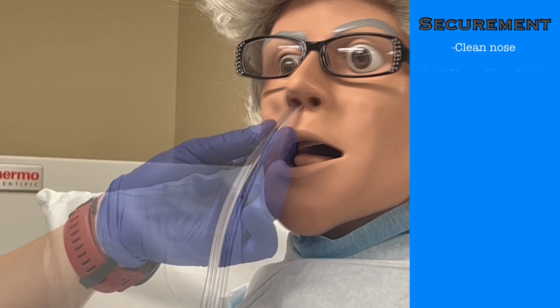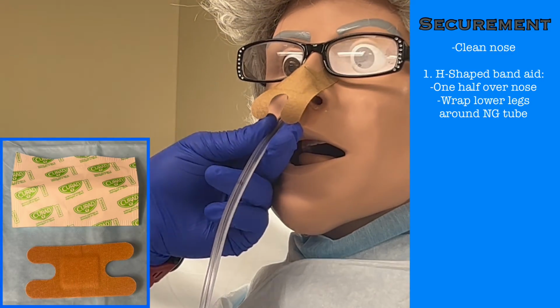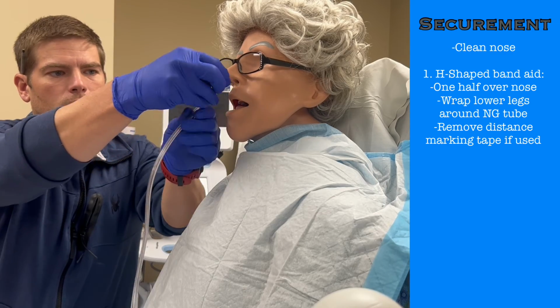We often use the H-shaped Band-Aid. Put one half over the nose, and use the remaining 2 ends to wrap around the NG tube, securing it to the nose. If you marked the length with tape, remove the tape at this point.